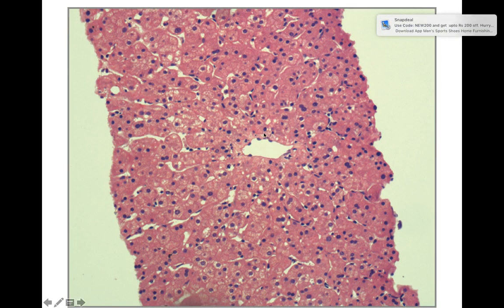Now this image is showing the central vein of the liver parenchyma. It is called a central vein because it lies in the center of the lobule. So what is a lobule? A lobule is a hexagon of the liver which is defined by Kiernan when he joined several portal tracts and gave a lobular structure of the liver. We'll be discussing this in the first talk. And because the vein lies in the center of the lobule, it is called the central vein.